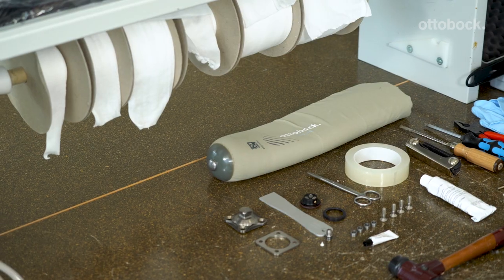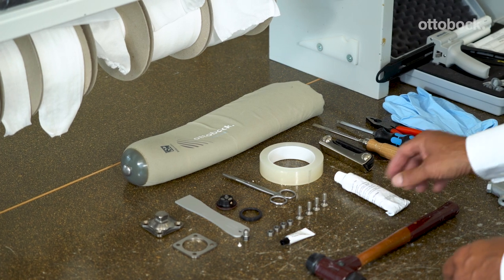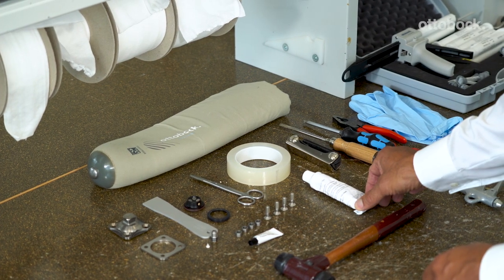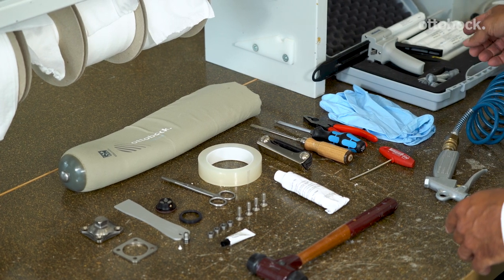You will need the following materials and tools: the components included in the DVS kit, including silicone bonding agent, hand tools, and optionally the Otto Bock Beta-Syl.